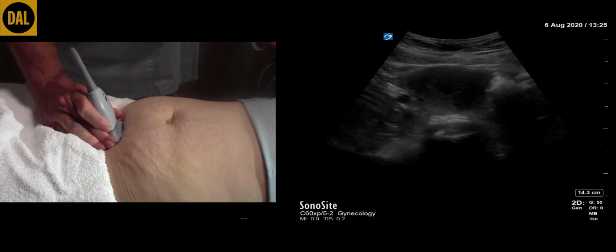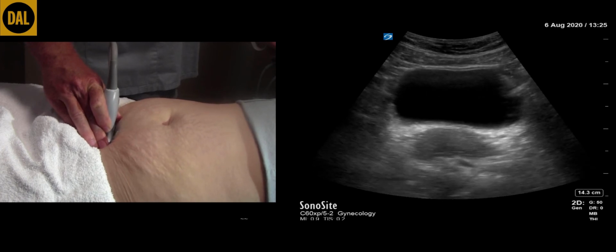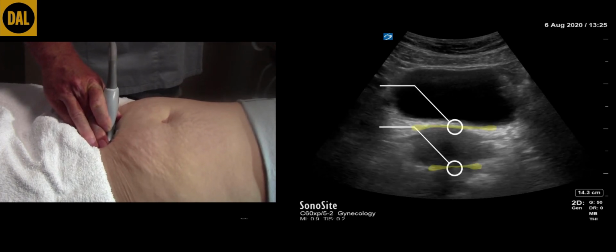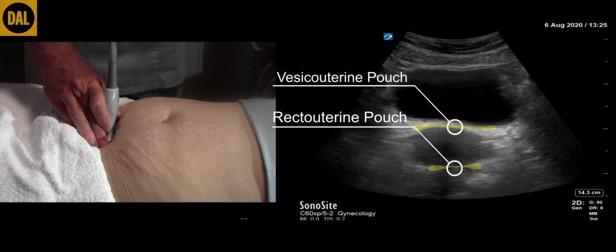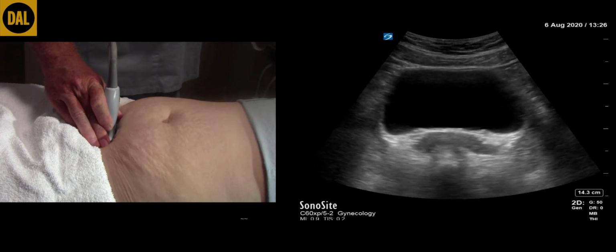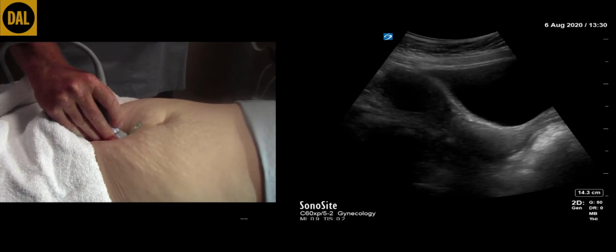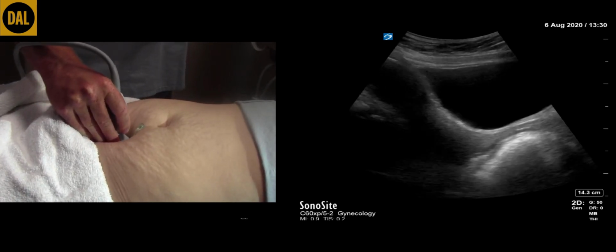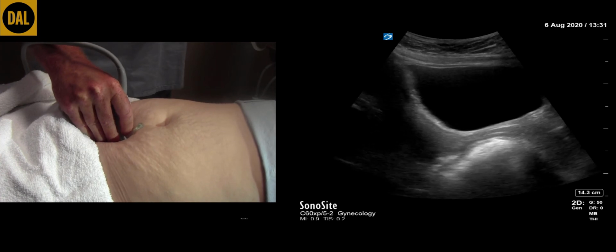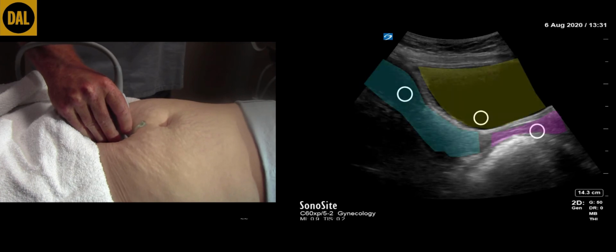Return the transducer to the lower part of the body of the uterus and inspect for free fluid within both the vesicouterine pouch and the pouch of Douglas. This will appear as anechoic collections in these areas. Then rotate the transducer 90 degrees clockwise and place the transducer in the midline in the longitudinal plane. Once again, rock the transducer caudally in order to visualize the bladder with the uterus and vagina sitting posteriorly.